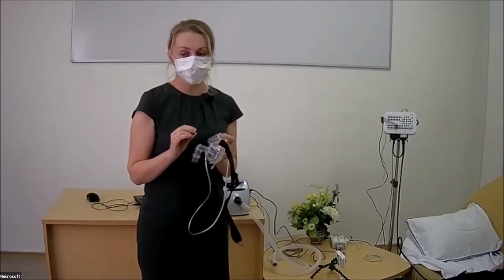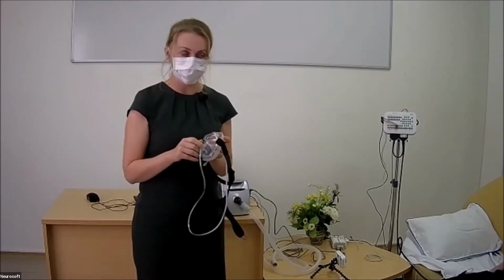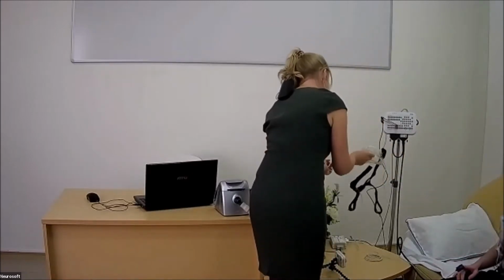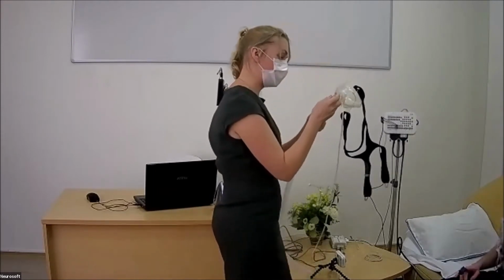In the majority of cases, one airflow channel is enough to perform a titration test. But now we don't take the thermistor sensor off the patient. I connect this mask to the PAP system with this flexible hose.